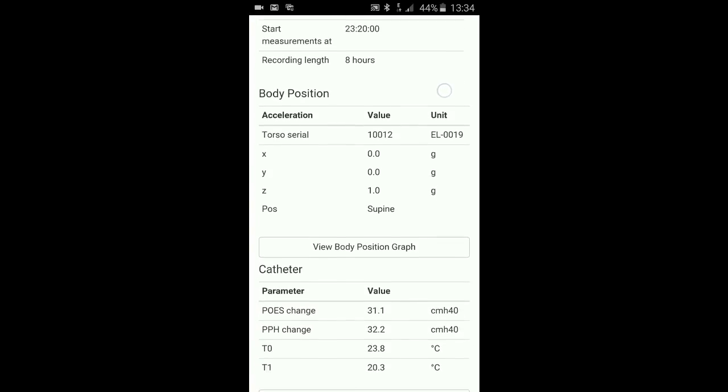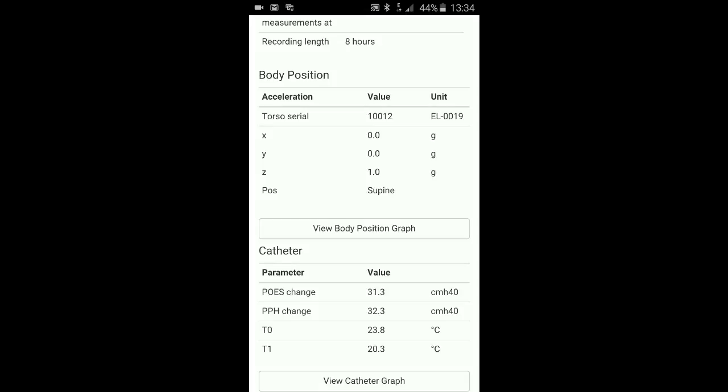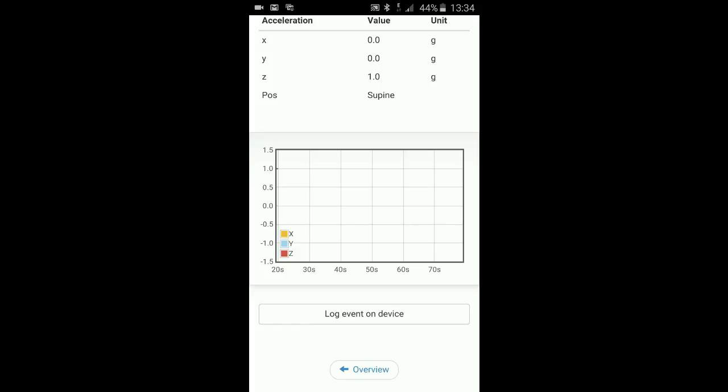Body position sensor is shown here. I can also look at the graph of the body position sensor. I can change the orientation of the unit. It will change the body position.